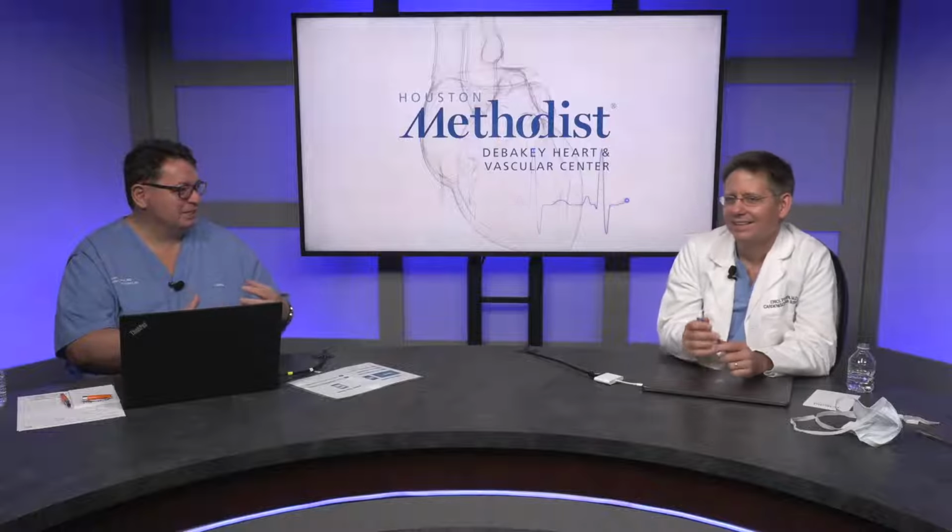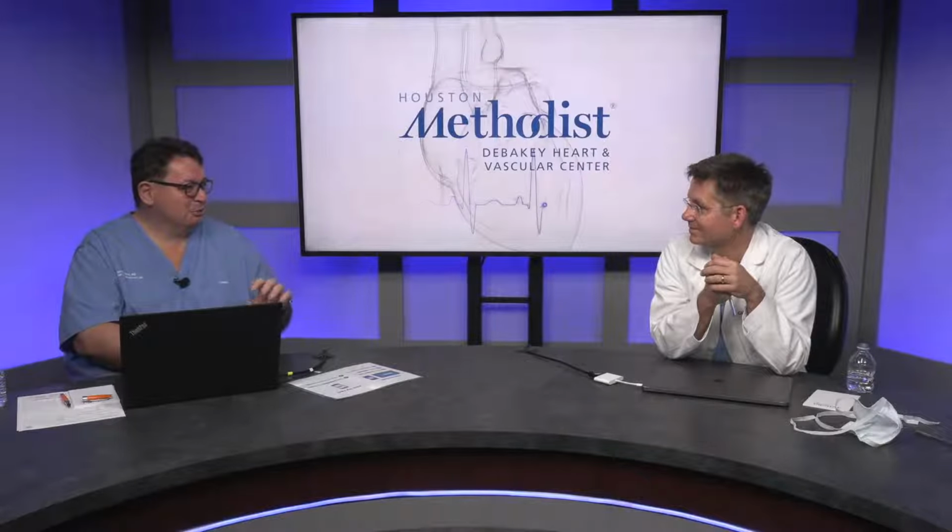Do you touch them, or do you wait until they are 400? Yeah, so do you mean that they're seeing debris within the lumen? On ultrasound, we see that there's something inside the lumen, and we cannot tell you if it's clot or not, because those are the things that we just haven't done into pathology that much, but we know there's something sitting inside.